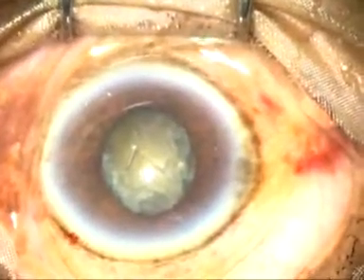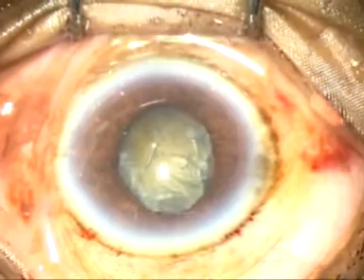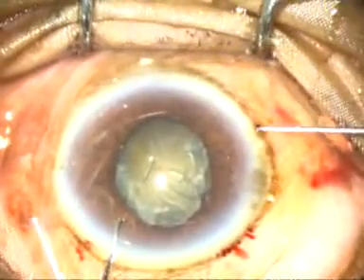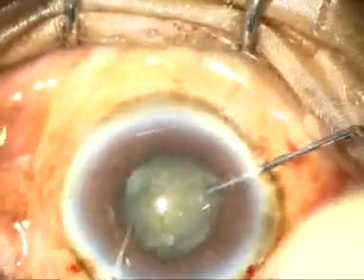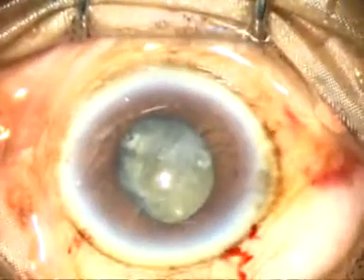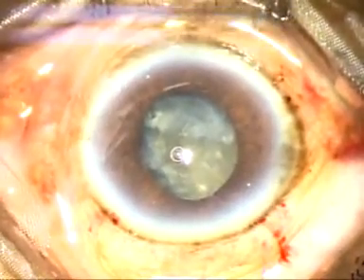I will inject viscoelastic substance and take two instruments — the left hand has the chopper and I have taken a Sinski hook in my right hand. With these two instruments, I can move the nucleus. Since the pupil is small, it is very important that the nucleus rotates freely.